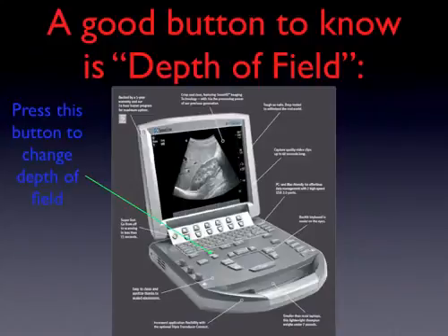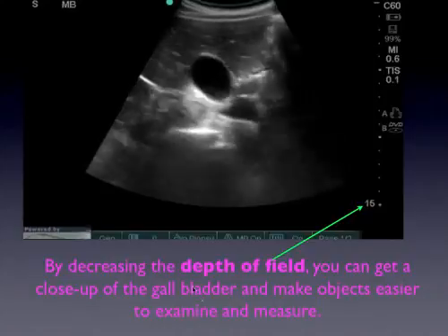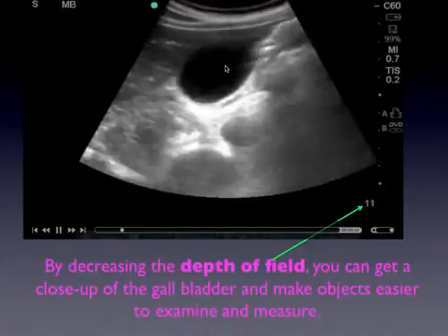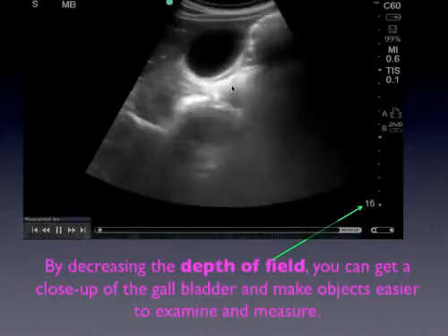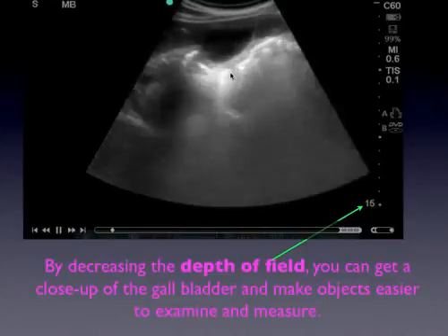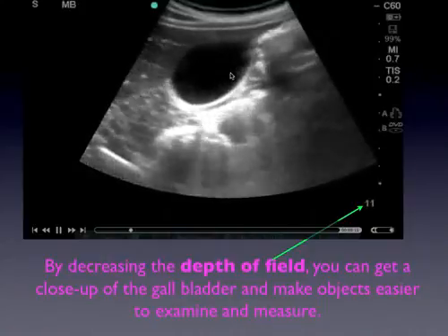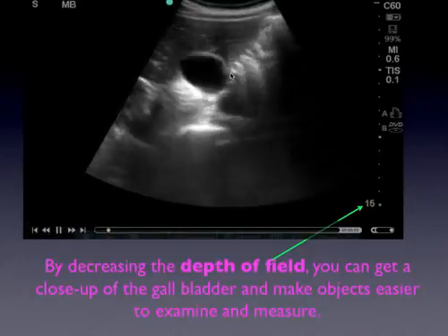Now, a good button to know is the depth of field button. If we change the depth of field, then we can change the imaging. So here's a gallbladder, and take a look, we're at 15 centimeters, and over here is the size of the gallbladder, and we see it getting bigger and more clear as we move down to 11. This is simply a fold in the gallbladder that's coming and going with respirations. So again, we start off at 15, and then as we change the depth of field, the image becomes much easier to see and certainly easier to measure things such as the size of the portal vein, the anterior wall thickness, and so forth.